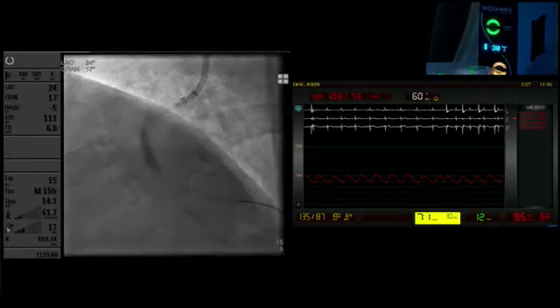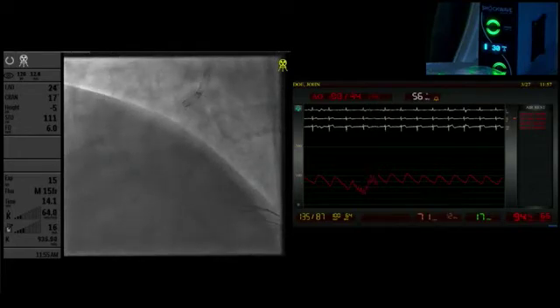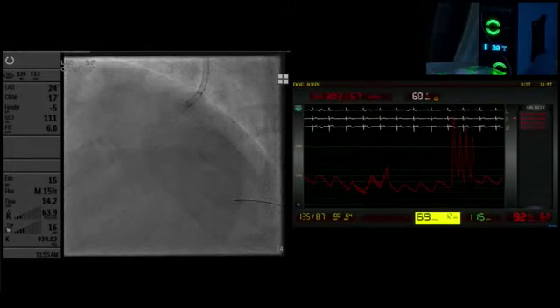Yeah, you utilize all the catheters, so that would give you the max effect. 6 is the nominal pressure for the balloon. That's why. So a nice OCT run, if you can do it on 54, that would be great. Yes, sir, I will do that. Are you ready to go, sir? It'll show you directly.